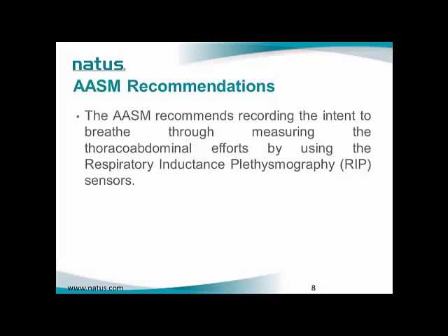As the diaphragm is a stronger inspiratory muscle in comparison with the intercostal muscles, and as there is a limit to the maximum pressure change in the thorax, obstruction often leads to paradoxical movement of the chest and abdomen, where the abdomen increases in circumference while the chest decreases.